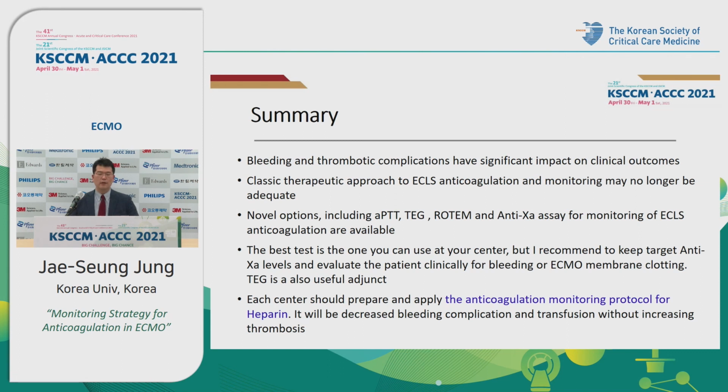Each center should prepare and apply an anticoagulation monitoring protocol for heparin. It will decrease bleeding, complications, and transfusion without increasing thrombosis.